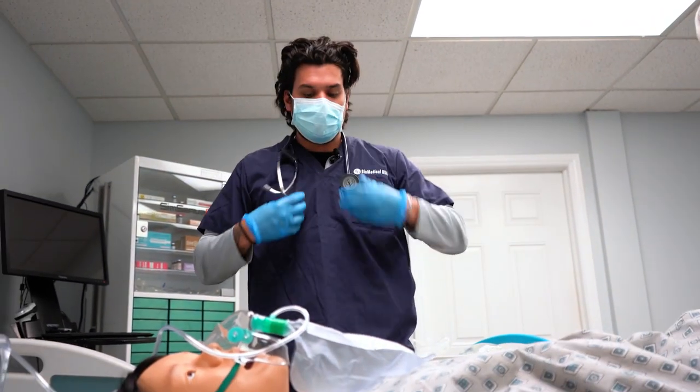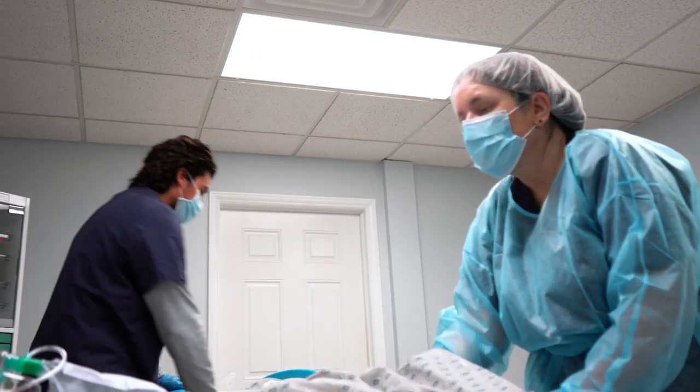BP is 110 over 60, pulse is 96. I'll get the catheter kit ready. Great.